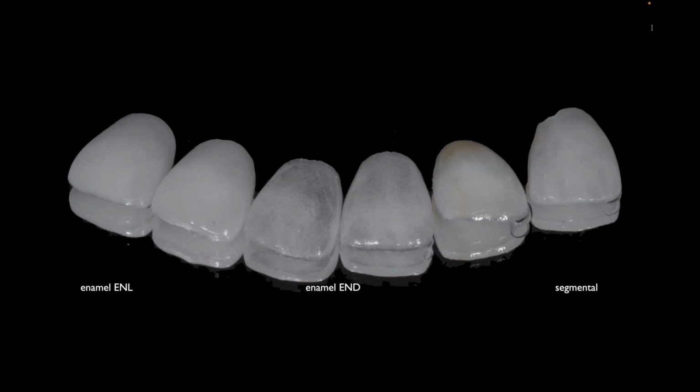And on the segmented, you should notice several different things. You see the color, you see the value, you see some translucencies. And that to me is really how we should be thinking of our enamels, not just one, right? I always say, for the 2 or 3 powder builder people up there, and I get it, you get used to doing it a certain way, you can't really create nature with just 2 or 3 powders. I know we'd like to, but it doesn't work that way. If you need to add another dentin or a mamelon material, and you definitely need to add another enamel or 2, to really make the value of what you're trying to create from the outside to the inside work together.